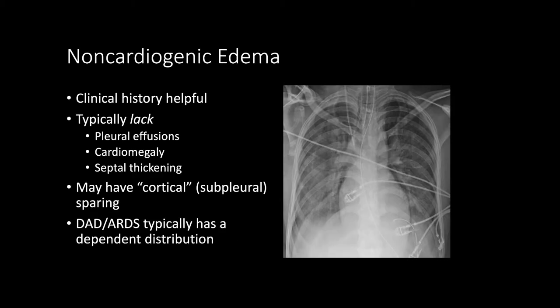There are other entities that can simulate pulmonary edema. Non-cardiogenic edema — more commonly termed acute lung injury or diffuse alveolar damage — can cause pure edema from non-cardiogenic causes. These patients tend not to have pleural effusions; they tend to have normal heart size and often do not have septal thickening or Kerley B lines, although those may be present. In some cases you'll see sparing of the immediate subpleural lung.